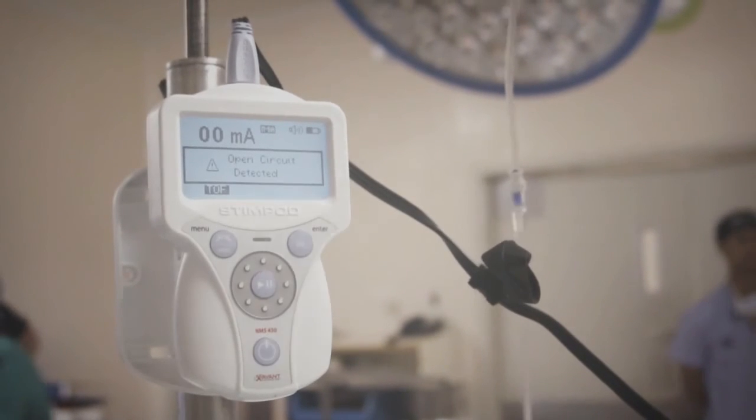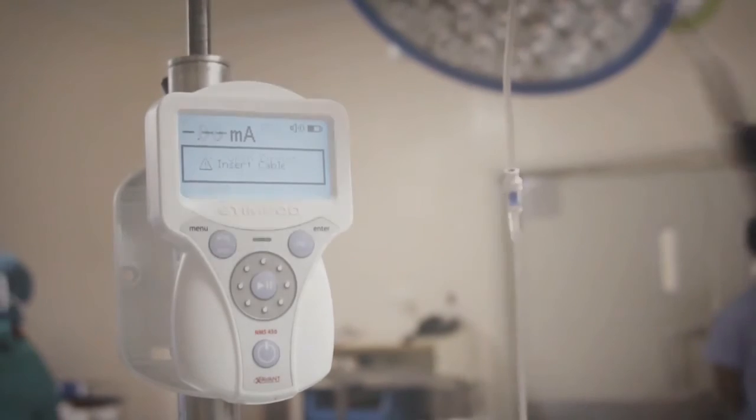So far, the Stimpod NMS 450 has been used to great success. In my experience, using a Stimpod in day-to-day anesthetic practice to monitor neuromuscular transmission fulfills the attributes of an ideal monitoring device. It contributes markedly to patient safety, it's cost effective, and it's most certainly reliable — and that's exactly what we want from a monitor in day-to-day anesthetic practice.